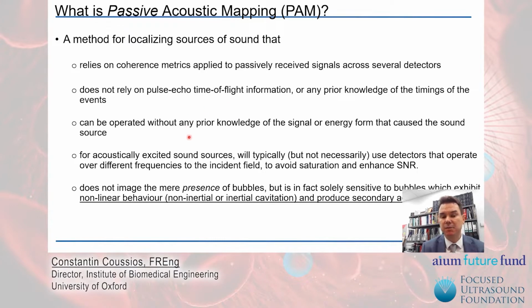And this type of technique can be operated without any prior knowledge of the signal or energy form that caused the sound source. And we do not image the mere presence of bubbles, but only in fact those bubbles which are active in the therapeutic sense and therefore exhibit nonlinear behavior, either non-inertial or inertial, and produce secondary acoustic emissions.